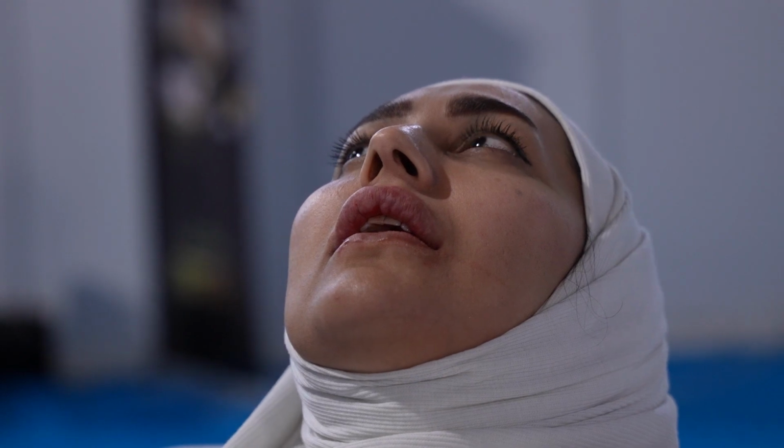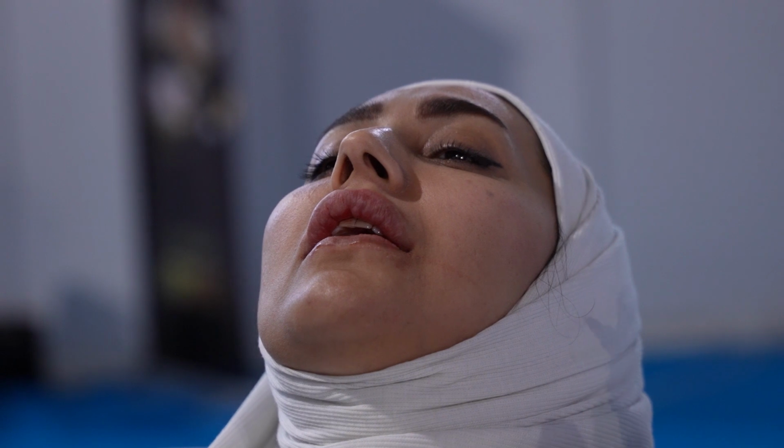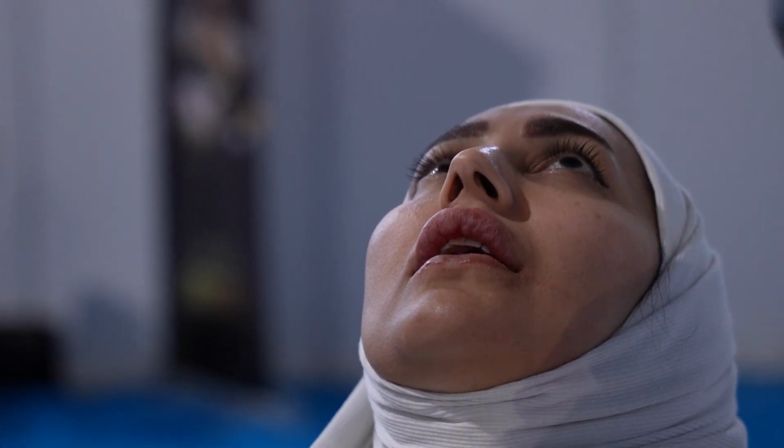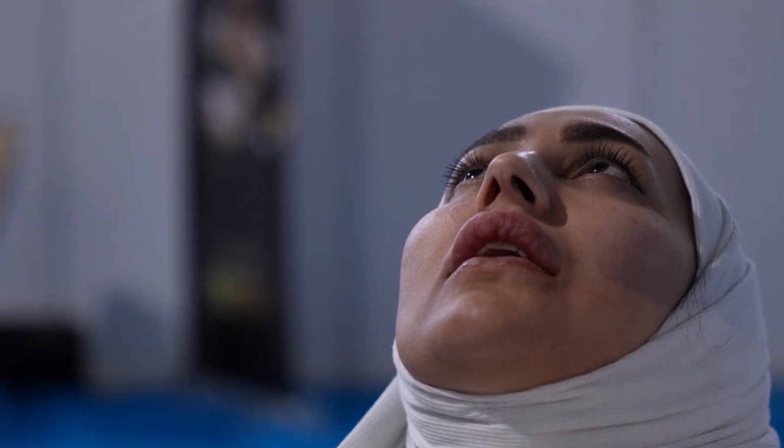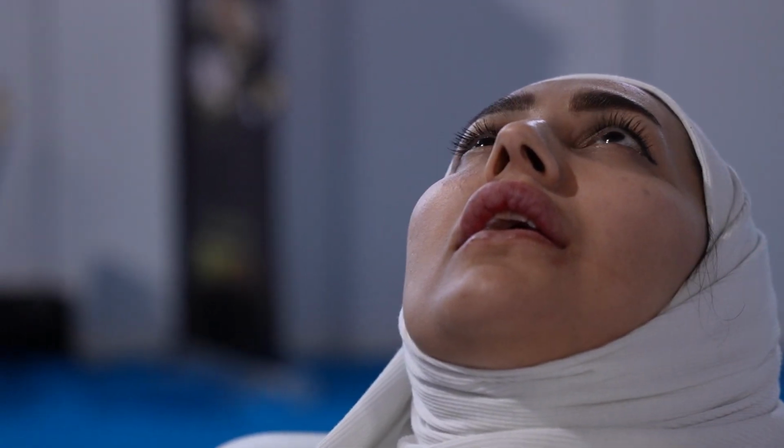For the lower lip, do you reach to the middle of the lip? No. Just for volumization, we can touch the body of the lip. For contour only.